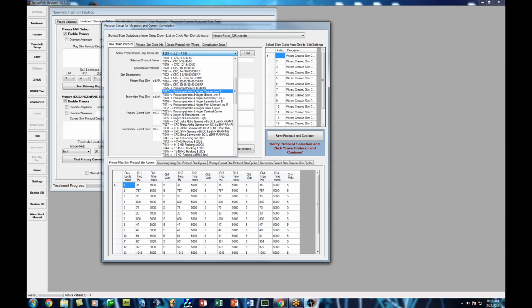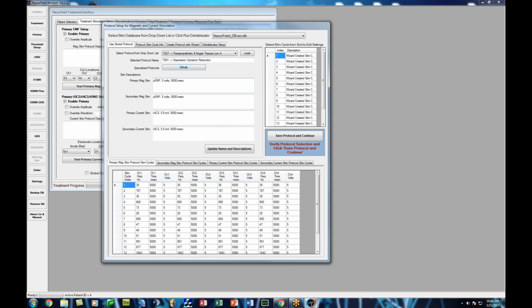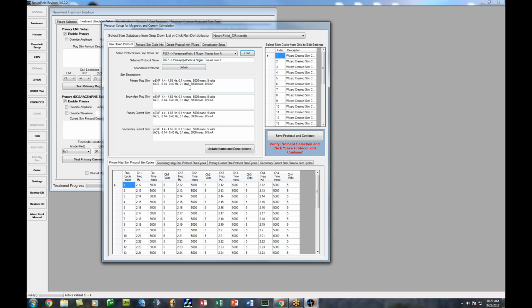These are kind of cool because you can give a parasympathetic stimulation with the tACS unit while simultaneously having coils over a person's belly, which is really nice. It's a way to really calm somebody down and stimulate their gut simultaneously.